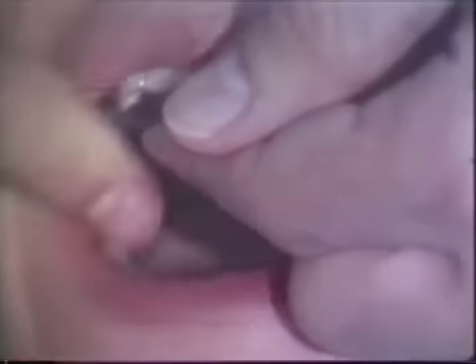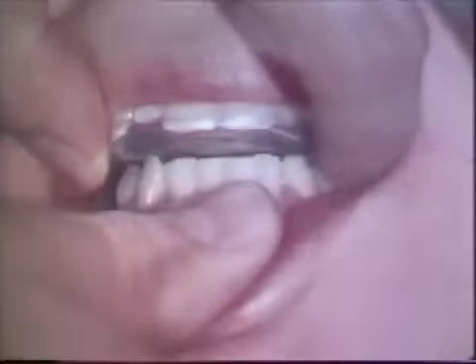Simultaneous contact of the teeth with the appliance must be achieved. Occlusal adjustment is begun by adding strips of 28-gauge green casting wax to the occlusal surface. The jaws are tapped together in centric relation.